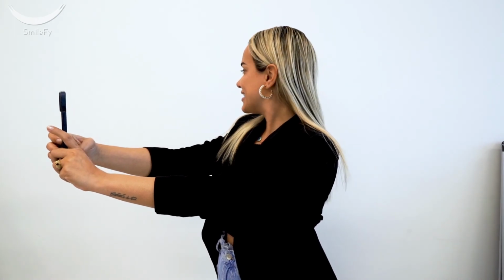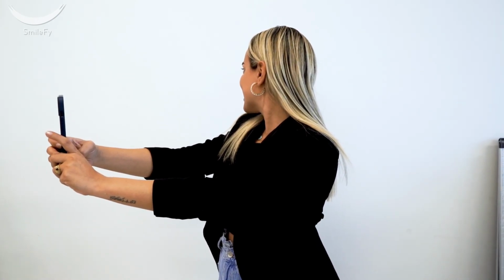To do the facial scan, open Bellus 3D in the patient documentation and make sure that the patient is looking straight and with a big, wide smile. The Bellus 3D will give you the directions. Just turn the face to the left, to the middle, and to the right. So creating a digital patient will not only give you a better experience when it comes to diagnosing your patient, but it will also give your patient a spectacular experience in your office.